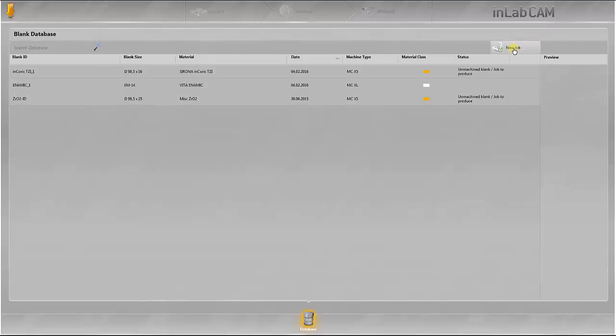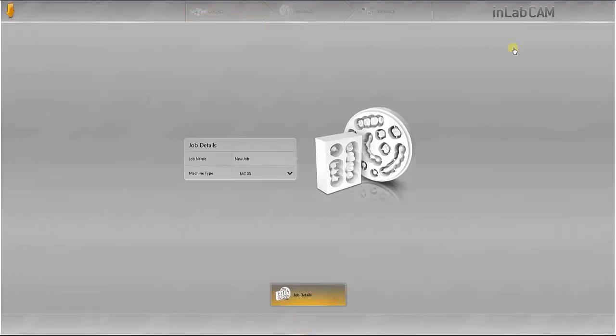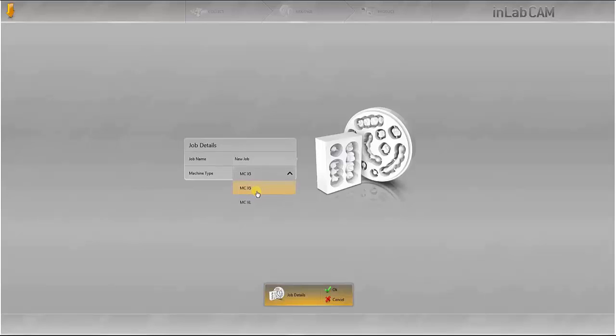For this, a new job is created. The MCX5 is selected as the machine and confirmed with OK.